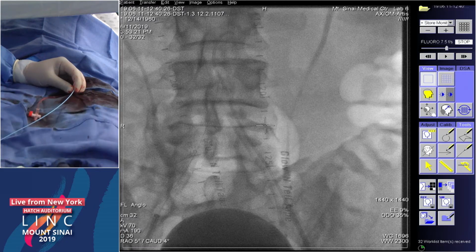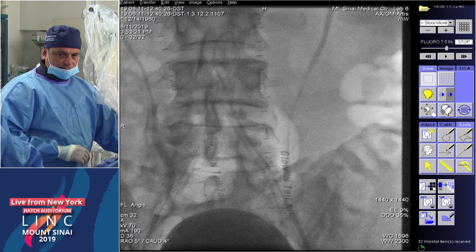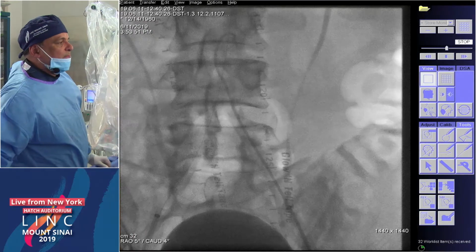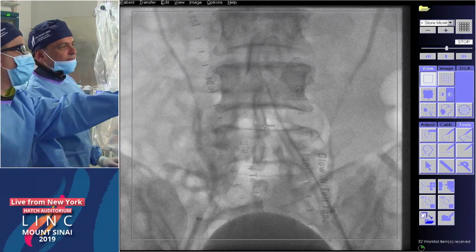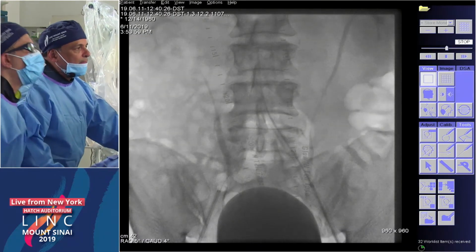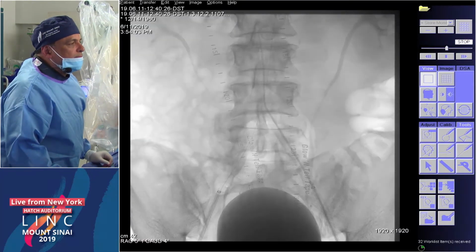It definitely does make sense because even if you haven't done Shockwave, there is still a risk if this is a supercalcified lesion, then you won't be able to dilate it. You can use balloons and then run into a situation where the balloon does not expand. And then you ask yourself, should I risk putting a stent there, or then I won't be able to expand the stent, and the patient starts having pain, and that leads to all kind of problems.